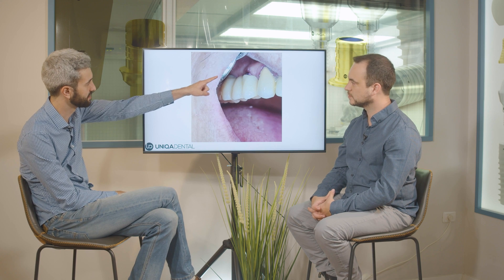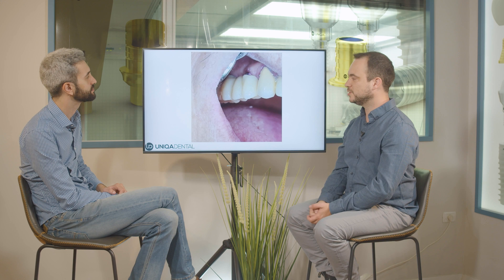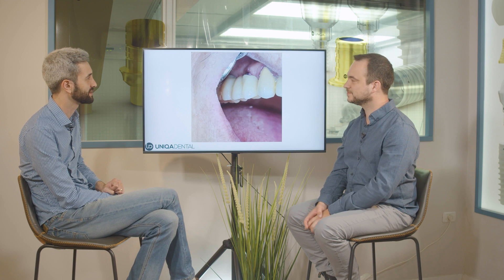And this is the little bit of titanium that you can see, but you can see it's not such a big problem — it's almost unnoticeable. You really need to check inside the patient's mouth to understand how minimal it is.